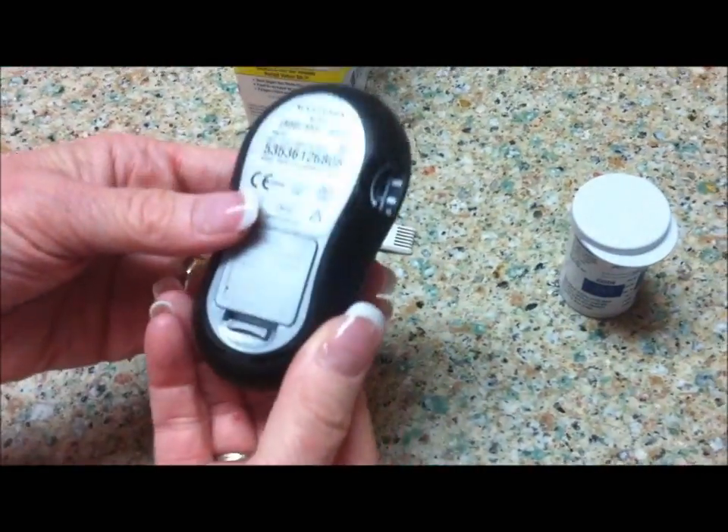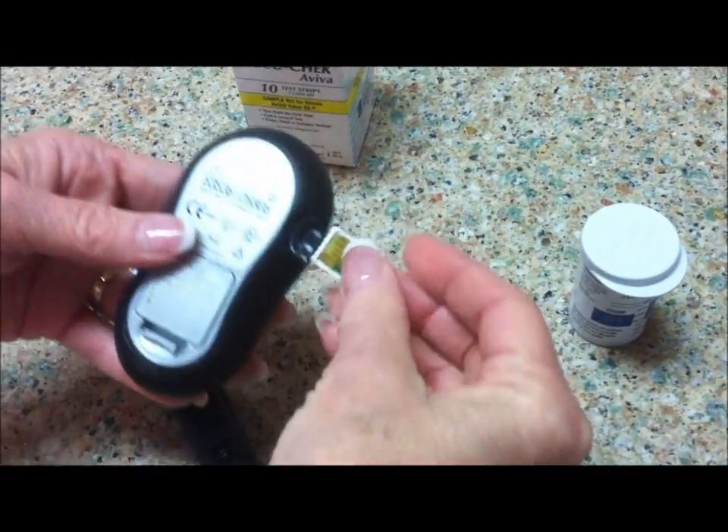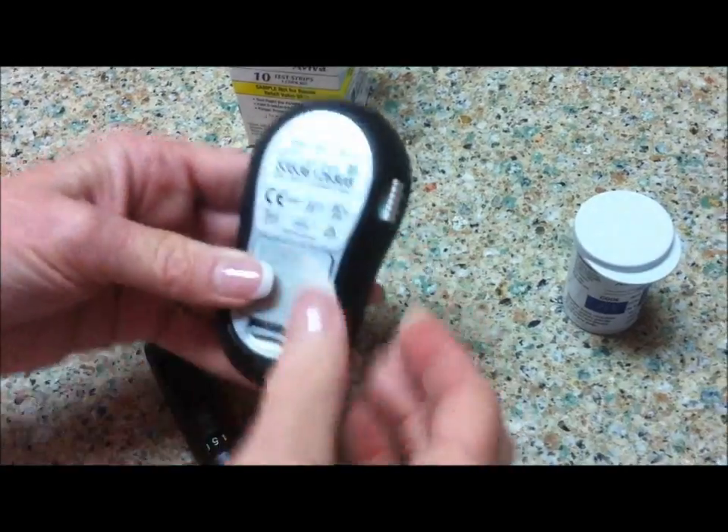The first thing you do is you turn the meter over. The code chip fits right in the side.